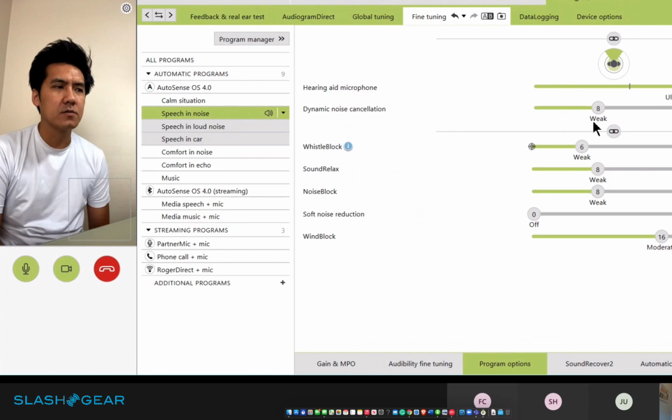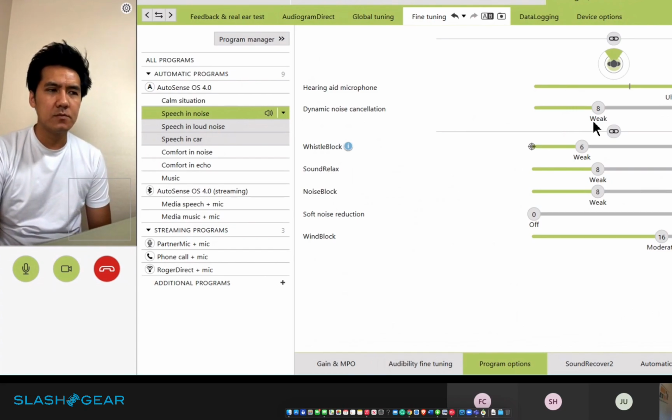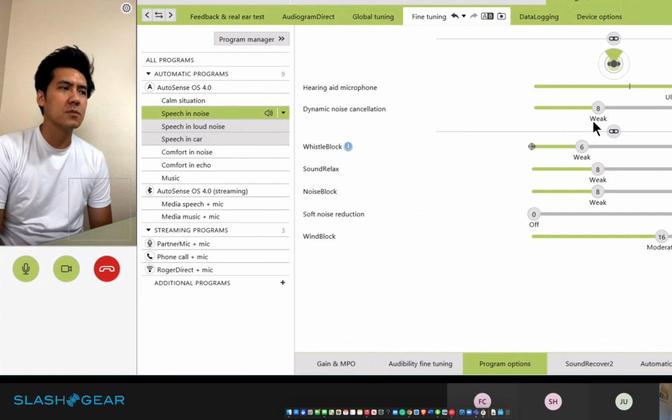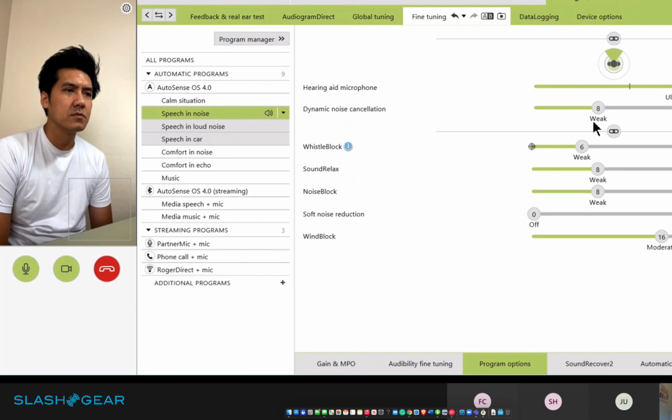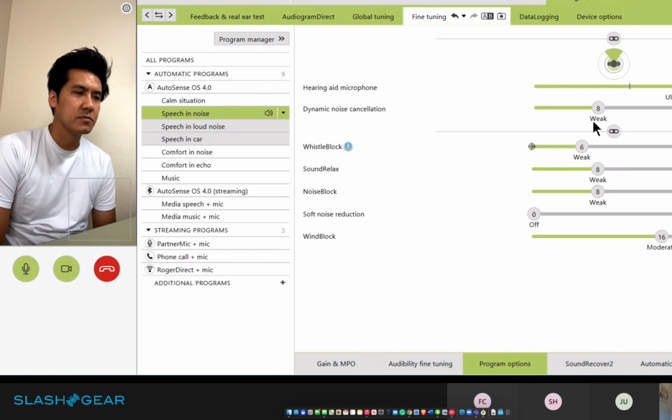Because the architecture of the building is different, the setup of where you're sitting at the table could be different. And so you may perceive certain artifacts because of that. So you want to make sure you are adjusting it to your comfort, and how you like the clarity to be. Got it. So there's more for the client to take control of.